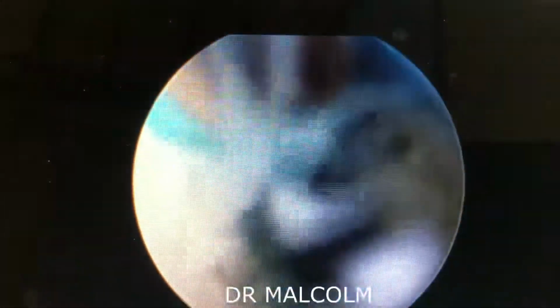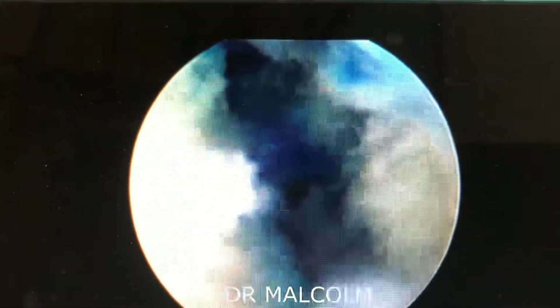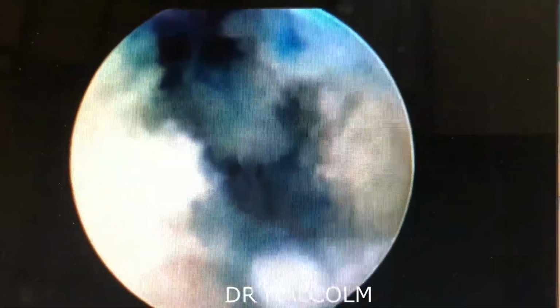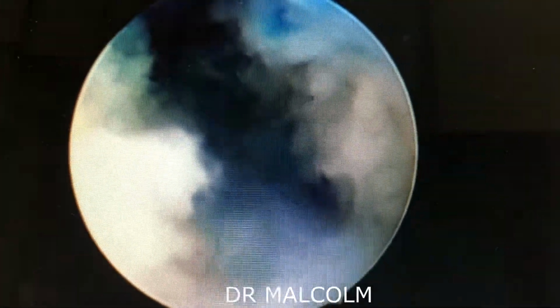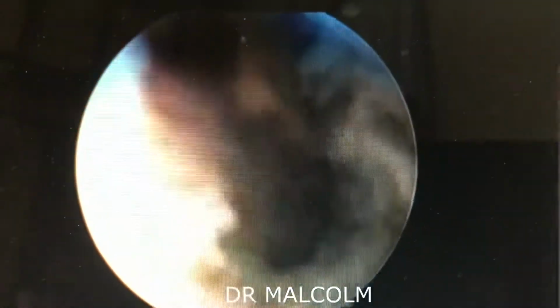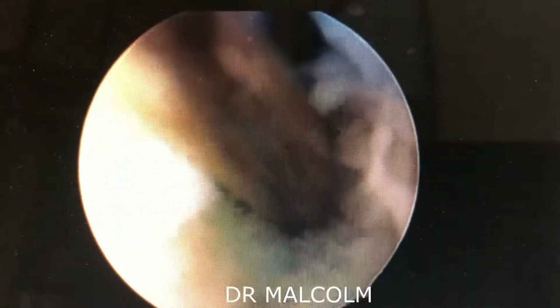It's amazing as to the amount of material that is accumulated over the years within such tears, causing severe pain, neurotization, and vascularization of the tear edges. This is a classic example of the human body at the stage where it fails to repair a tear and allows permanent vascularization, neurotization of the tear edges to occur, causing severe pain to the patient.